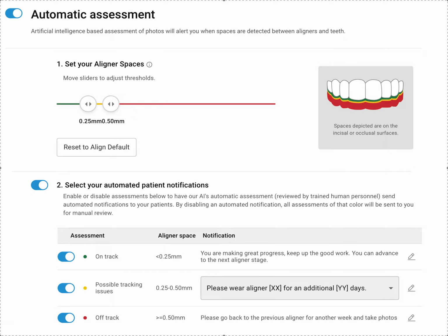They're confident. I can see things going on a mile away, even before they would know about it. Studies show, and you can talk to the folks at either Dental Monitoring or In Hand Dental, which are my two go-to companies for branded check-in companies. If you're not using Invisalign, or if you're using a lot of different systems and you want them all under one roof that you can access and control, and it's not controlled by a big public company, a lot of people don't feel comfortable having their content go to Align. Okay, I understand, I get that.